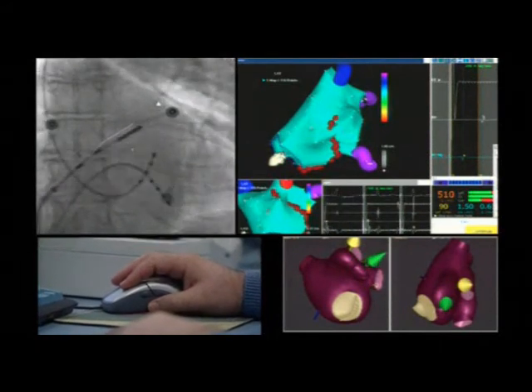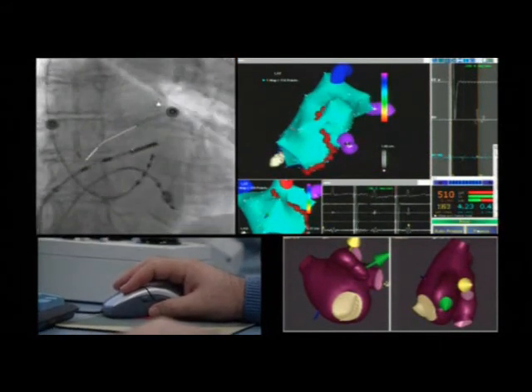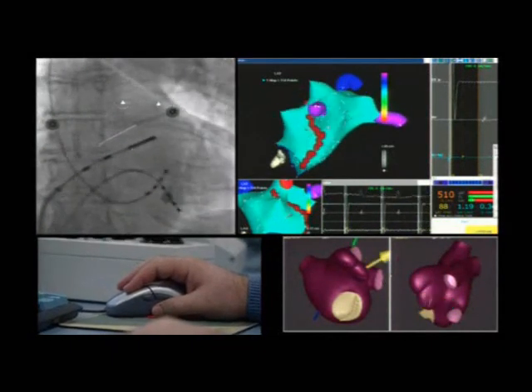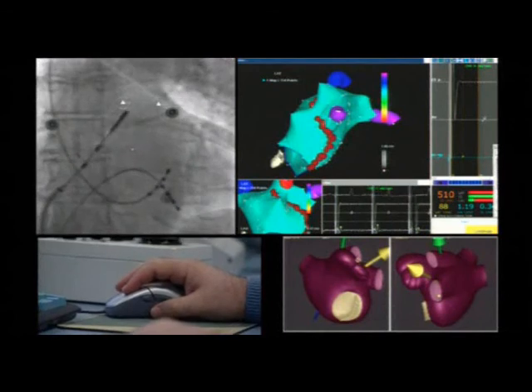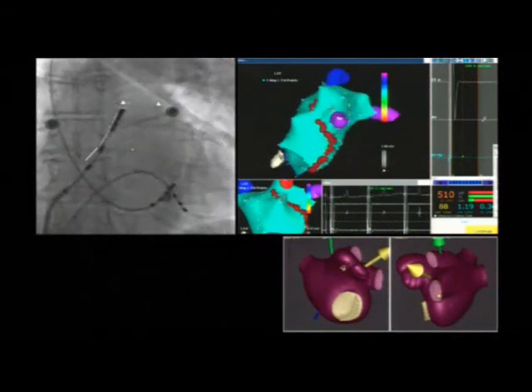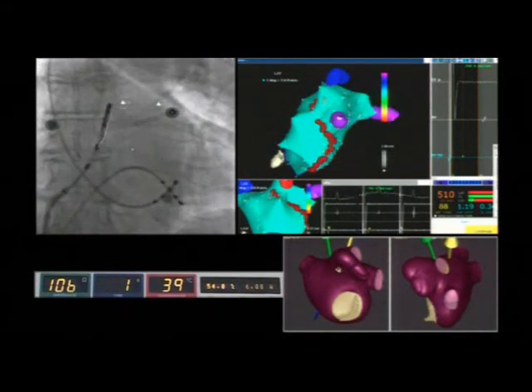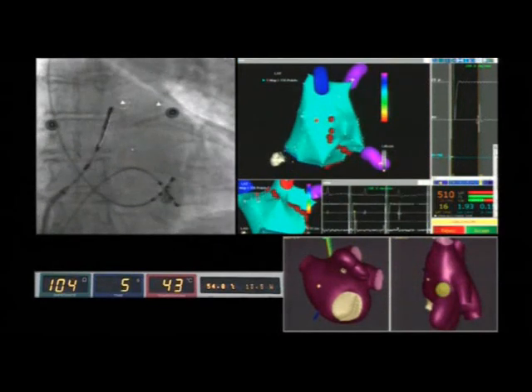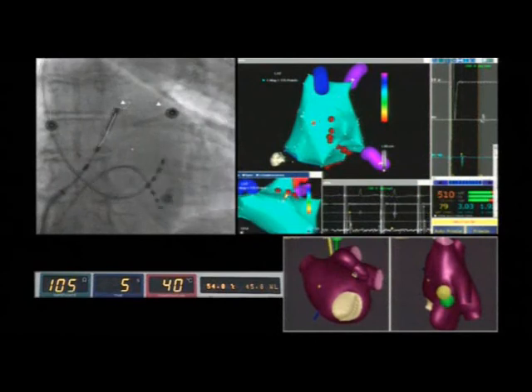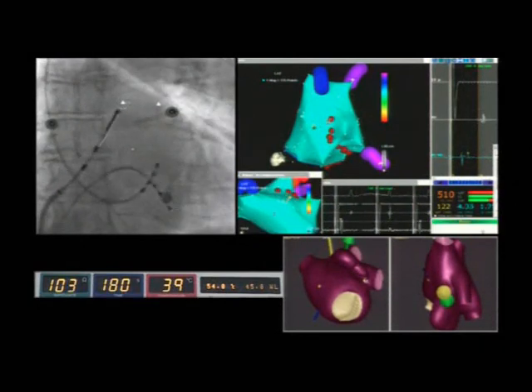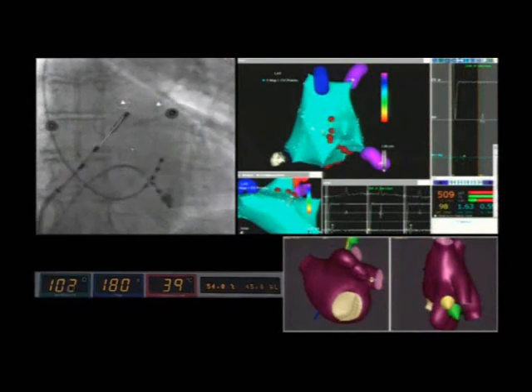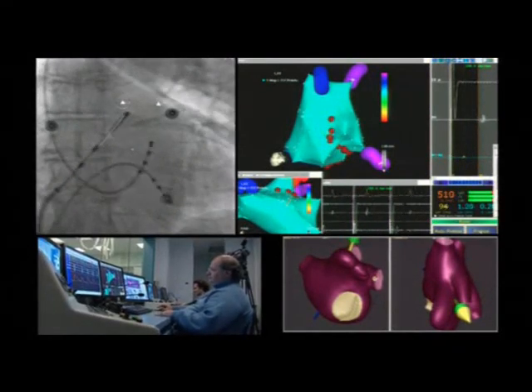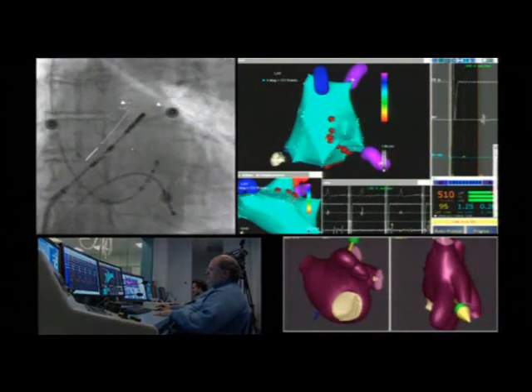We tailor circumferential lesions according to the single patient's anatomy and physiology if vagal reflexes are elicited, which may vary between different subjects. In some patients, encircled areas can be larger, varying between 20 and 30% of the left atrium, mainly depending on the atrial dimensions, which are usually larger in patients with long-lasting, persistent, or permanent atrial fibrillation. In addition, more radiofrequency applications are used particularly around the left superior pulmonary vein, where atrial electrogram potentials may be difficult to eliminate within a few seconds.